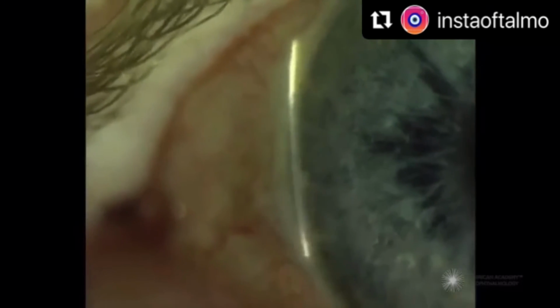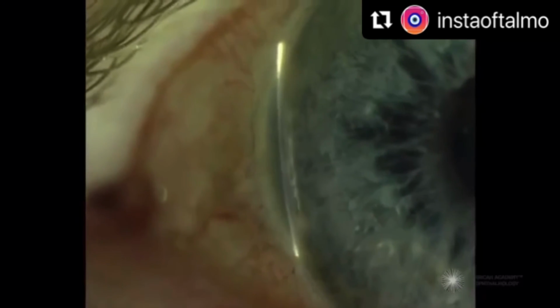At the opposite extreme, this is a patient who has very narrow angles. As we bring the beam of light in, we can see that there is just a hint of aqueous between the cornea and the iris. This is an angle one would consider to be a slit, and according to the Van Herick scale, an angle that is at risk for angle closure.